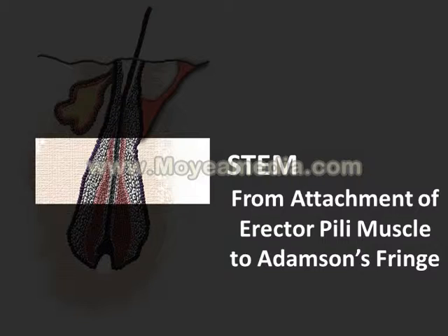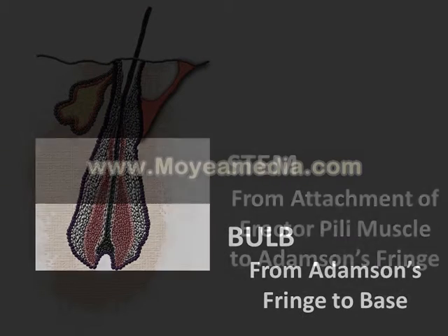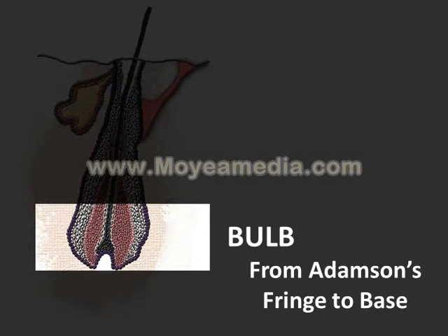The stem begins below the bulge region where the erector pili inserts and extends down to Adamson's fringe. And then the bulb region extends from Adamson's fringe down to the base of the hair follicle.